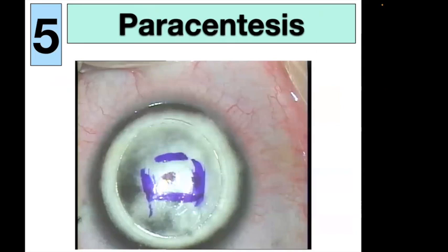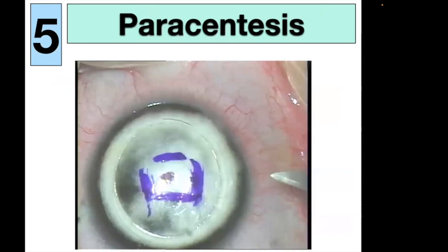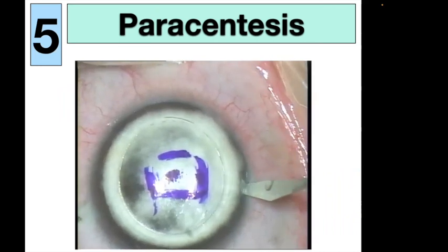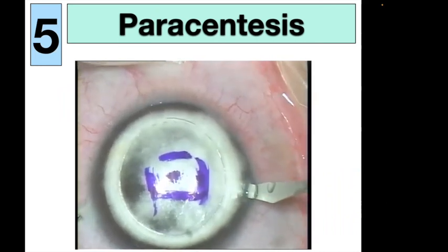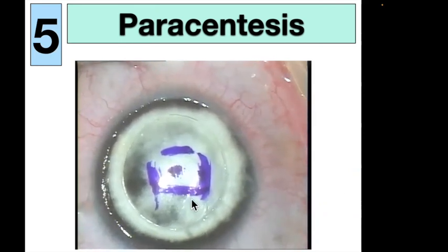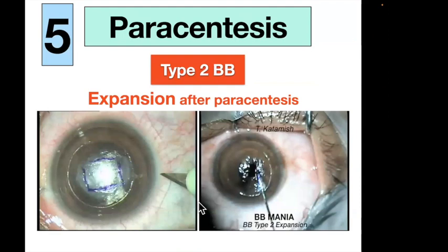This is the big bubble type 1. You have to go to the furthest part of the cornea in the extreme periphery and make a vertical paracentesis. In type 2 big bubble, as this one with the transparent edge, notice that the bubble expands. So if you are not so peripheral, you will injure the bubble by yourself.